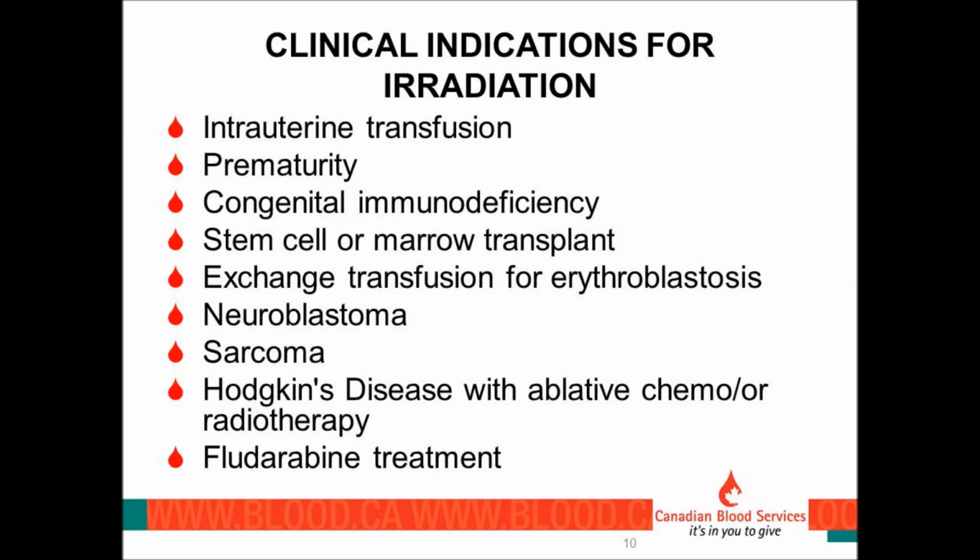The problem for us in the blood bank is that we have a spot on our requisition that indicates diagnosis. Most of the time, I'll have one of my cross-match staff tell me what is the usual thing written in diagnosis: low hemoglobin. So for us to guess any of these conditions, with the number one diagnosis written on our requisitions being low hemoglobin, is difficult. We do have a spot to fill out whether or not irradiated or CMV negative products are required.